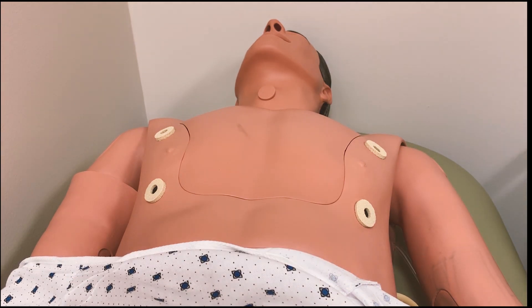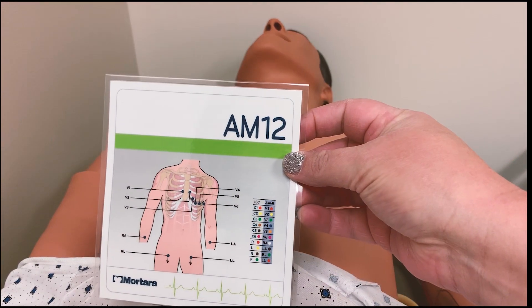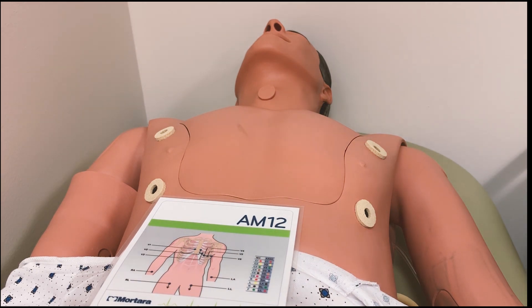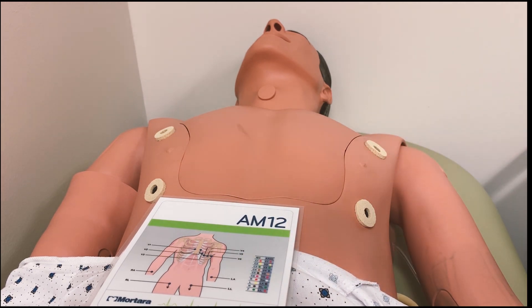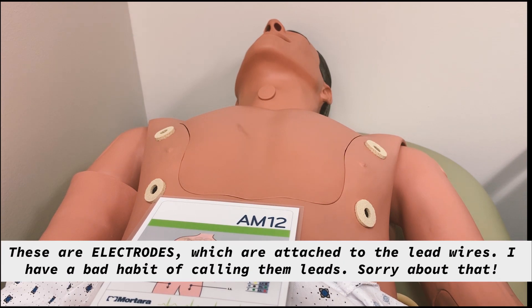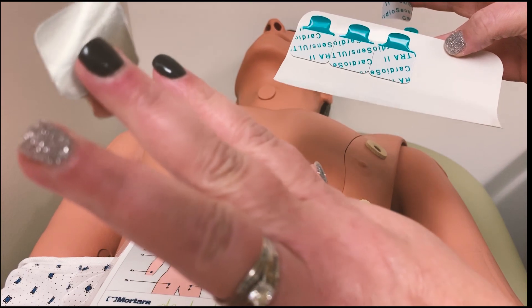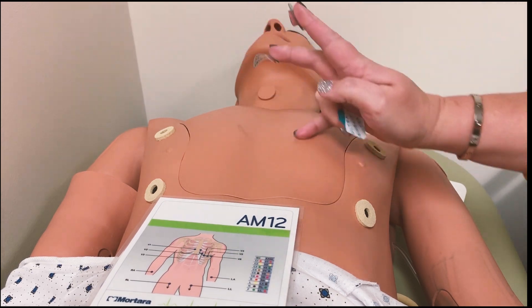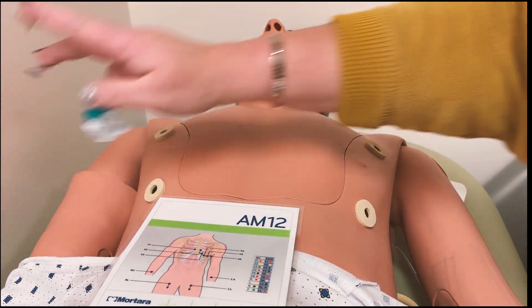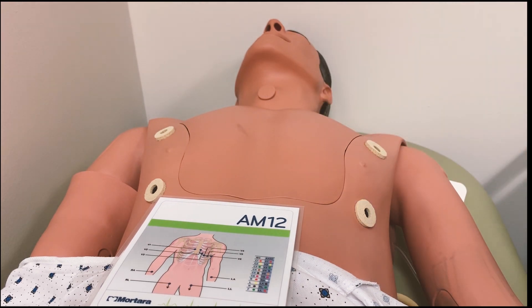We start with the chest leads. There are very distinct locations, like the fourth intercostal space, where you are to put the leads. These leads are impregnated with electrode gel on the back of them, so they are super sticky. Now, if you have a patient who is hairy, you may need to shave their chest, arms, or legs so that the gel on these leads sticks sufficiently.